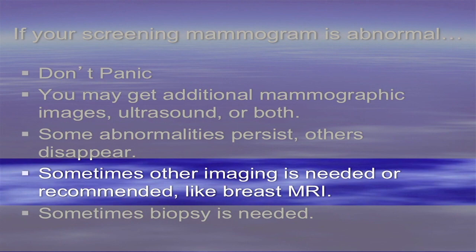Sometimes, and I really mean that, sometimes other imaging is needed or recommended, like breast MRI. I'd say that's rare, that you have an abnormal screening mammogram, you have a callback mammogram and breast ultrasound, and then still someone is recommending an MRI. It's very rare, and often, I'll speak candidly, it's based on the anxiety of the radiologist not wanting to miss something that could turn out to be a breast cancer.